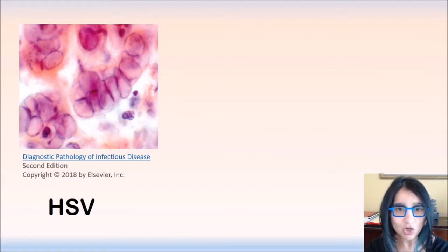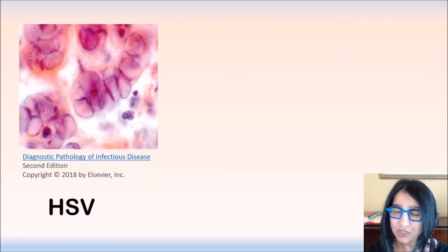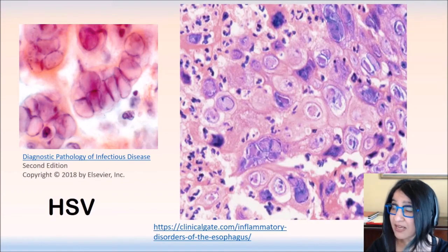So herpes inclusions have that characteristic appearance, and they also have the characteristic appearance that you're already noting as you look at this, which is that they have multiple affected nuclei kind of aggregated together. That is going to help you when you look at things on histopathology.